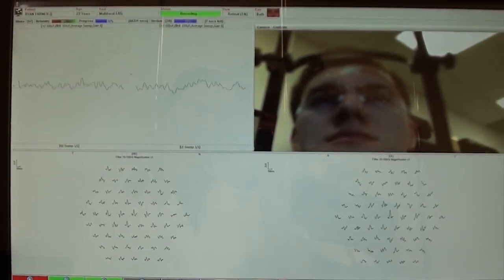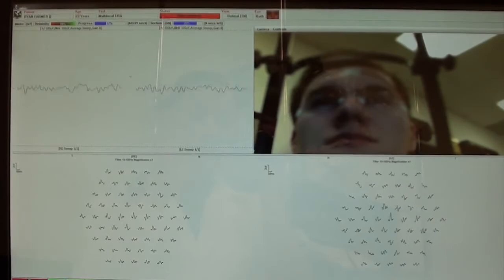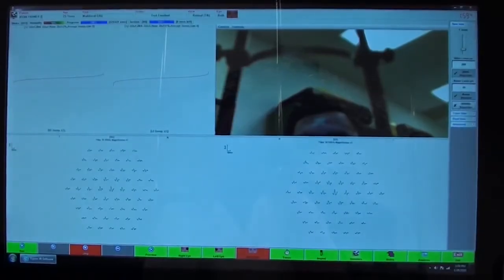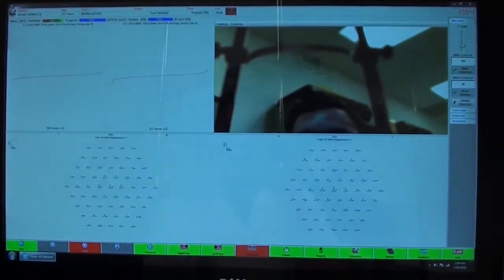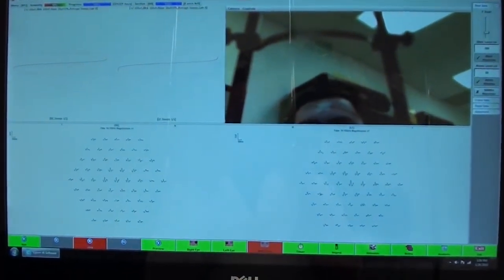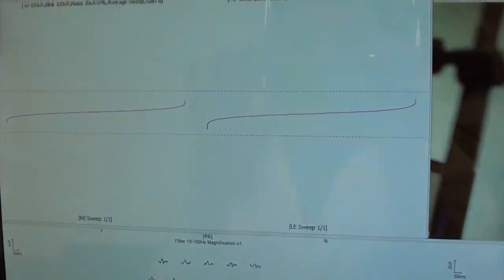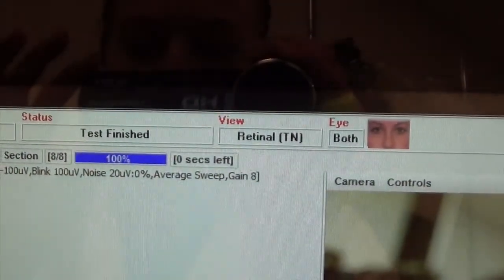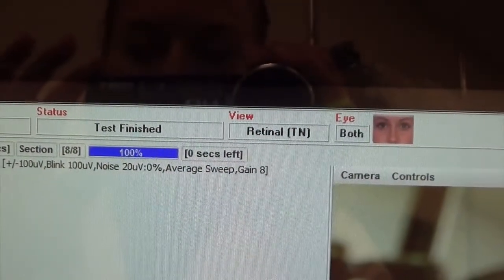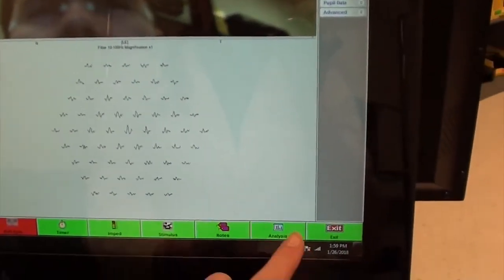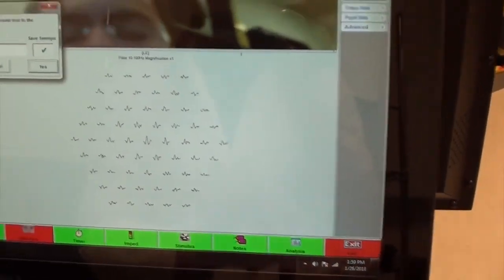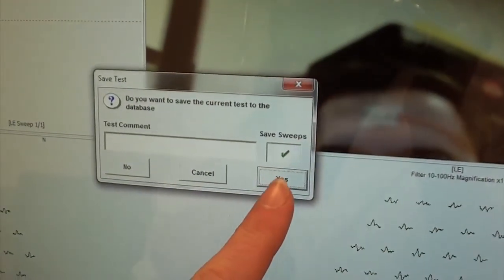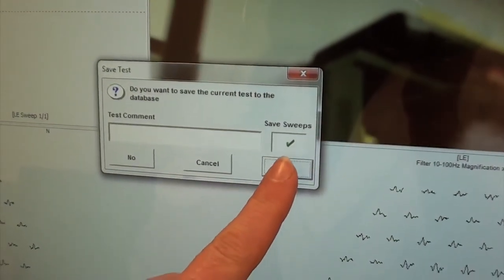Go between pausing and running until the test is complete. When the test is complete, the patient can sit back. You will see the words test finished as the status. At this point, go ahead and exit and save the test.